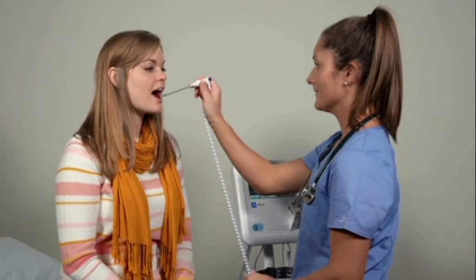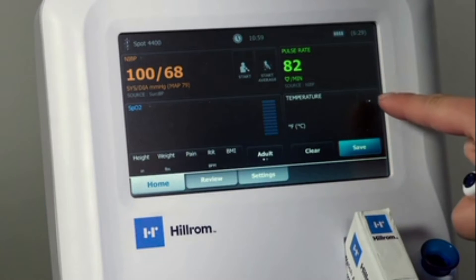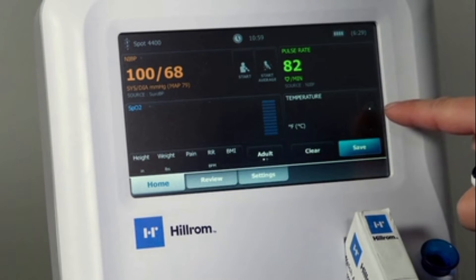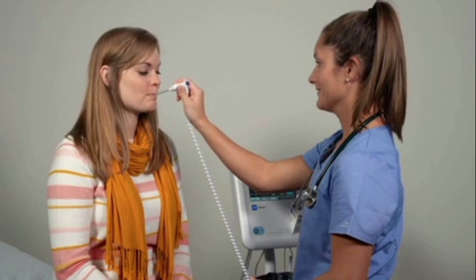A patient's temperature can be captured with a SureTemp Plus predictive probe that comes standard with all devices. To choose the temperature mode, select the position of the temperature probe by tapping the person icon. You can choose from oral, axillary, or rectal temperature modes. Just like other Hillrom devices, a rectal temperature requires the use of a separate rectal well and probe.